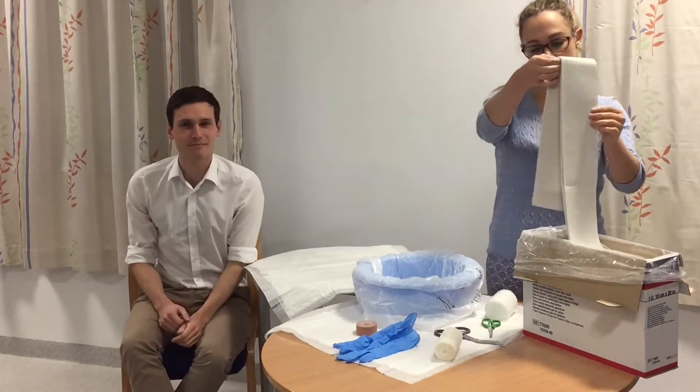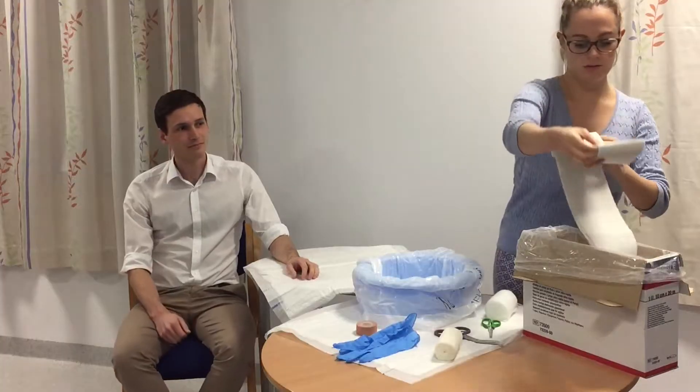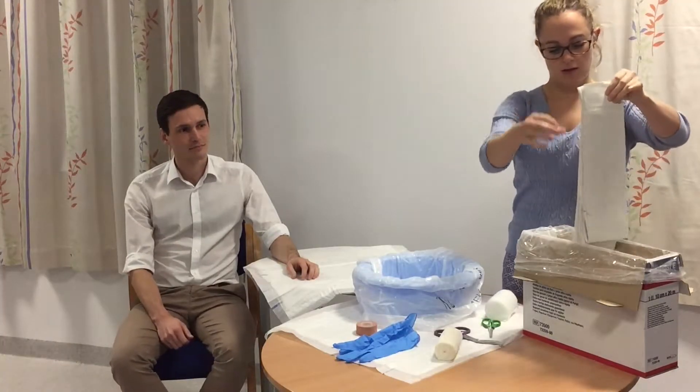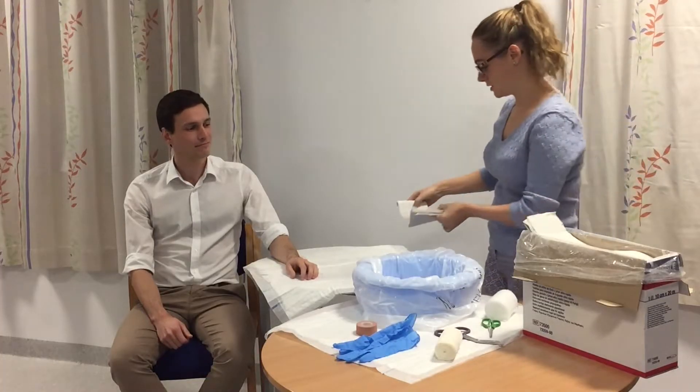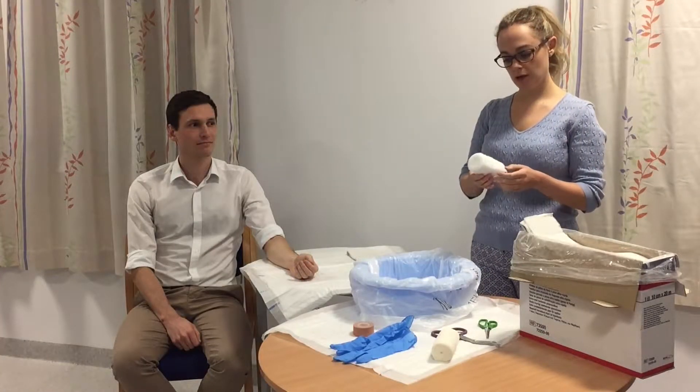We take the five strips and fold it again in three — one, two, and three — and then we cut here. Here's one that we cut earlier, which is just the right length.